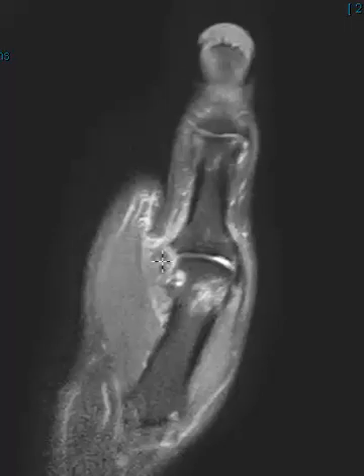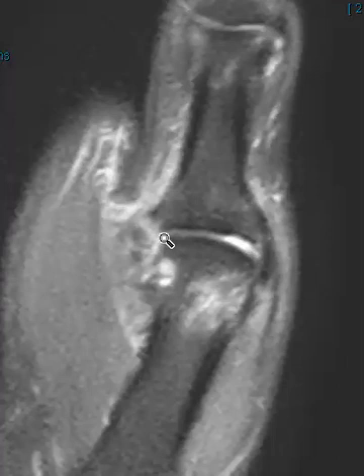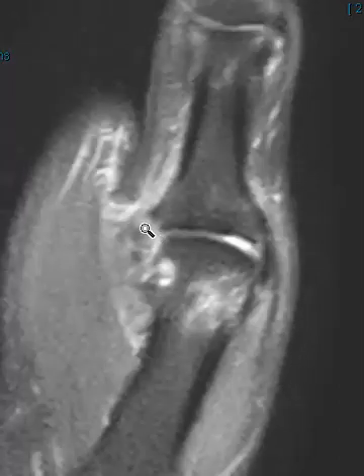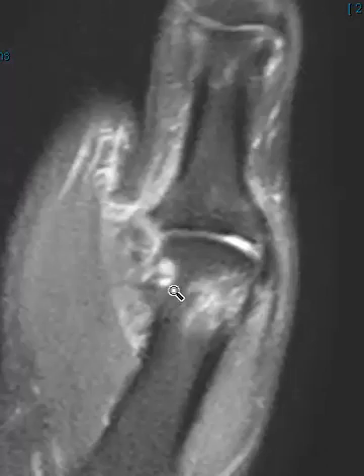You can see there's a little fluid-filled gap at that distal attachment. Right in here, see a little fluid collection — so it's completely torn and uplifted over here, completely torn. This is pretty straightforward; this patient is going to need surgery.